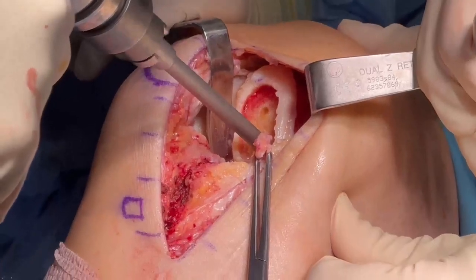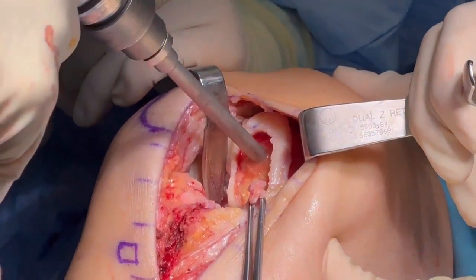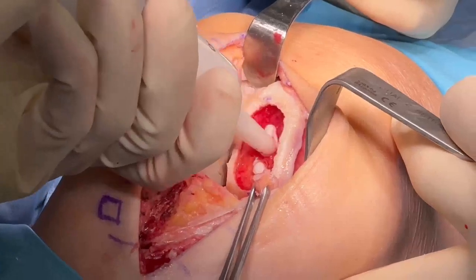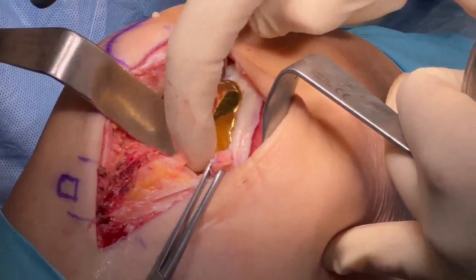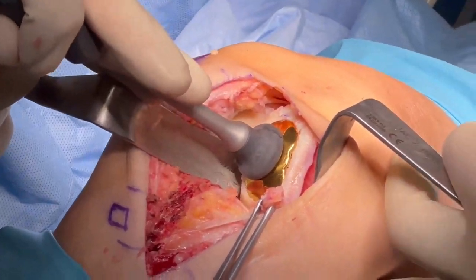The peg drill was inserted into the holes created by the pins and drilled until the shoulder on the bit contacted the bone. Cement was applied to each central drill hole and the femoral oblong implant was placed into position and seated with the femoral impactor.